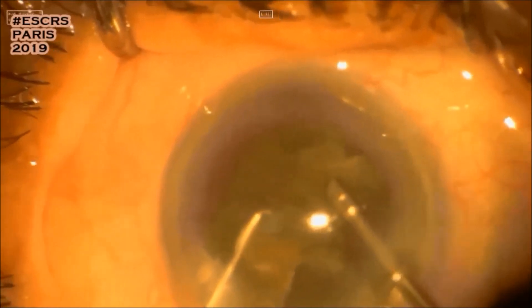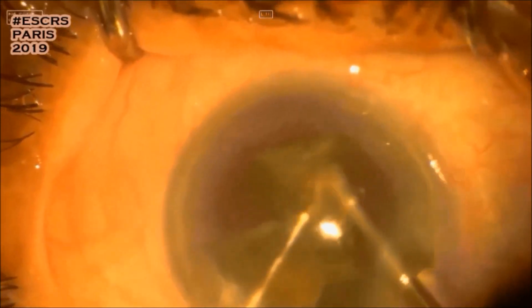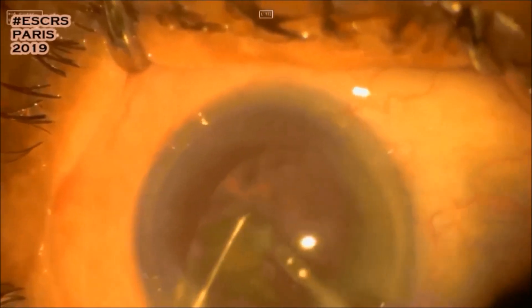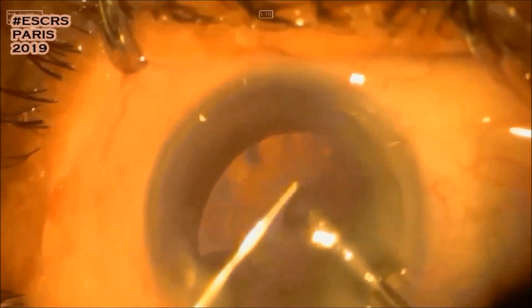Here I am breaking up the second half. Still a small residual piece remaining.